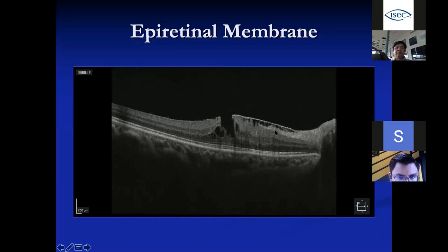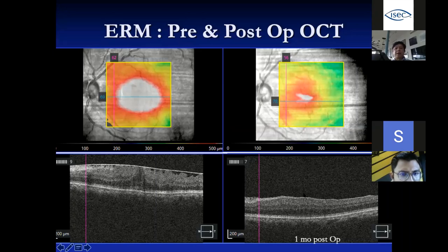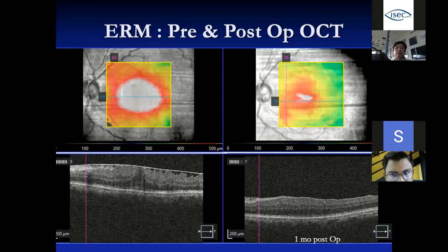The abnormal attachment of the retinal surface to the membrane causes a saw-tooth appearance, and contraction of the membrane causes retinal swelling and cyst formation — similar to macular edema. Here, a dense membrane is visible on OCT with abnormal tattering of the retina onto it. On the retinal thickness map, the white and red areas represent the thickened retina where the membrane is located. One month post-op after membrane removal, restoration of retinal nerve fiber architecture begins and vision starts to improve.